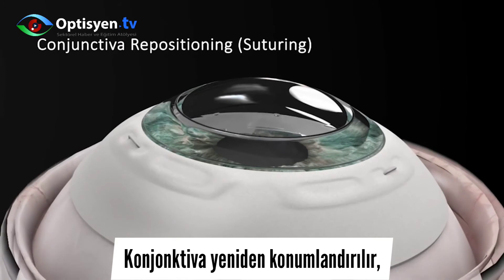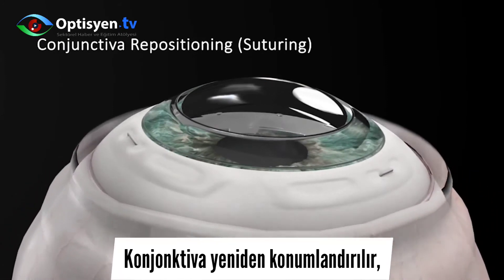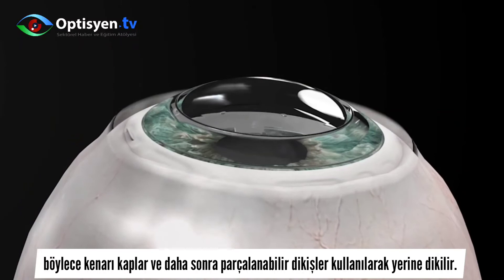The conjunctiva is repositioned, thus covering the skirt, and is then sutured into place using degradable sutures.